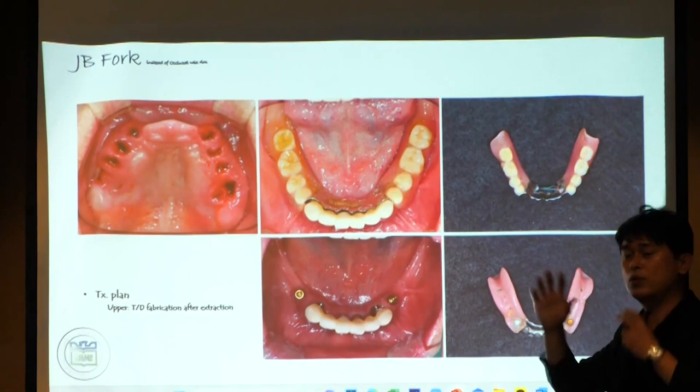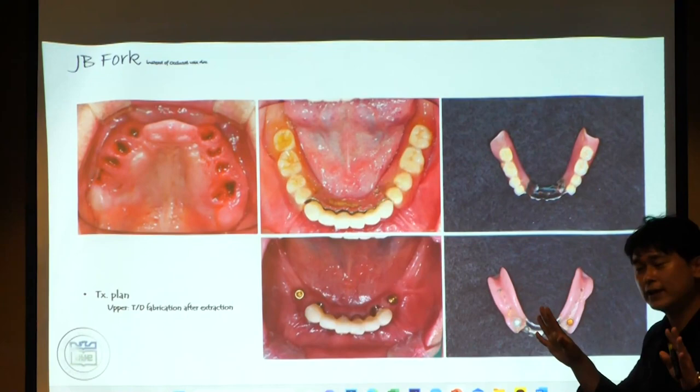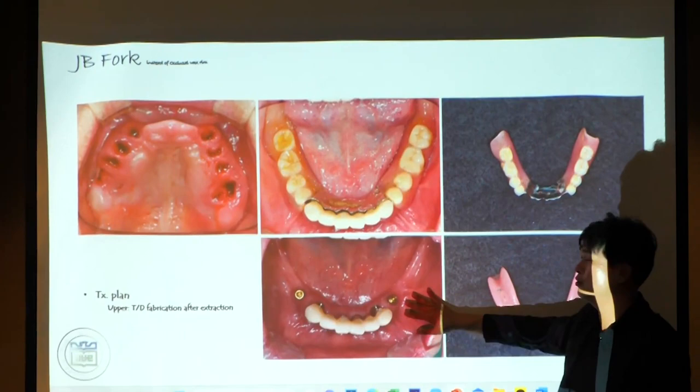You know, when the patient bites the anterior teeth, the labial bulge and the teeth have mobility, so we cannot detect the proper vertical dimension. So don't worry about that. Anyway, after extraction of the upper teeth, she wanted to use the old removable partial denture in the lower jaw.